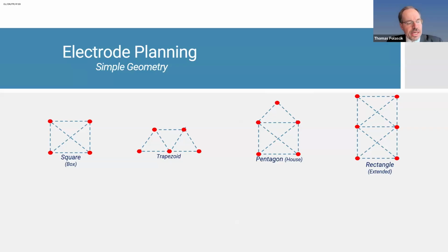Rothberg mentioned, you have to have a good team. So we're very fortunate that we have a radiologist who's dedicated to GU radiology, and same with pathology services. But we get these marked up front with a boundary. And I tend to like the square configuration if you have a nice shape that fits in that box with a good treatment margin. I've used trapezoid, pentagon I like if you have a little tail of an extension.